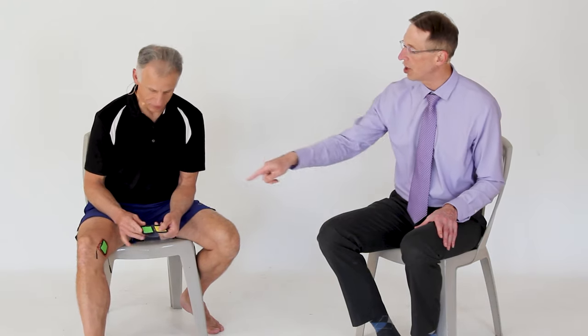With most TENS units, what you get is two channels and four pads. We're going to start off with just one channel and two pads. Channel one is yellow, it's supposed to be. I've got that on the back. That's all right. We'll go with channel two.